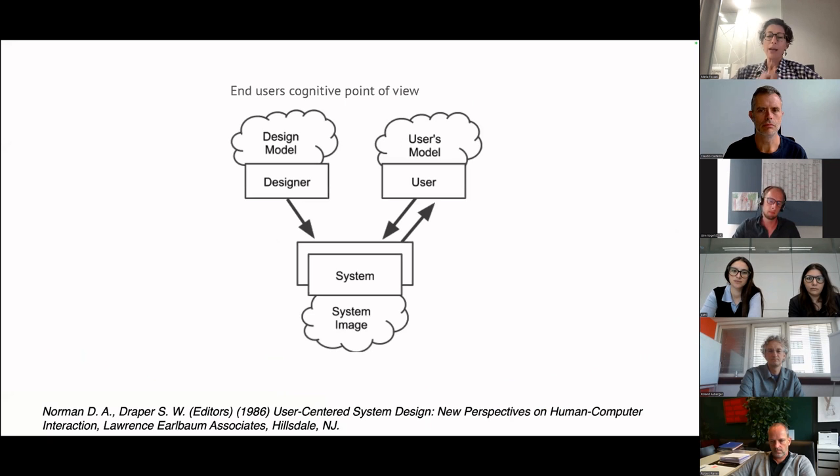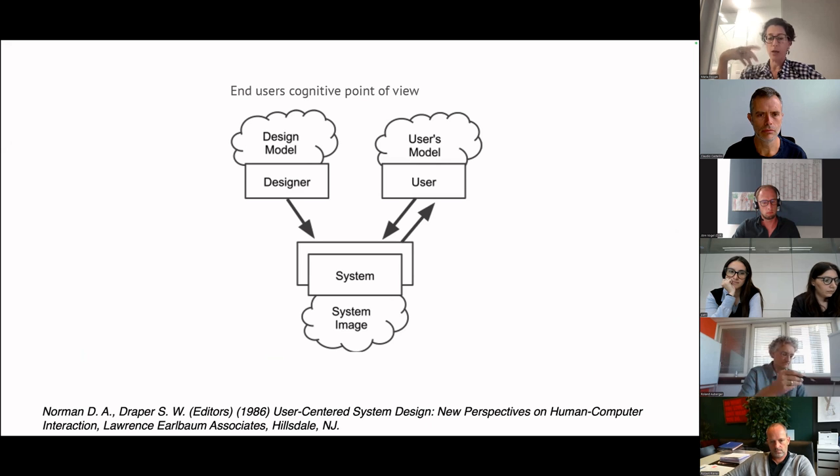Another great opportunity of the Cybathlon competition in series was to try to push really near the two main points of view, we can say. One is from the user point of view, and the other one is from designers, engineers, and the development team of the device. So all the preparation, all the training of the Cybathlon competition has really pushed to merge these two different points of view.